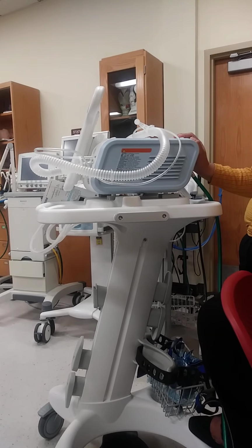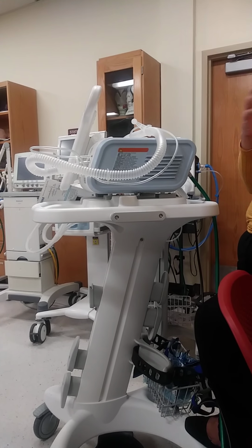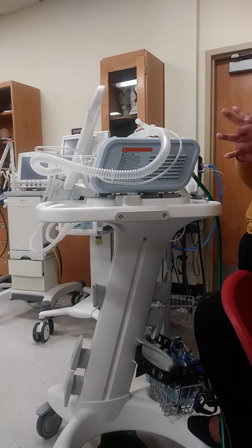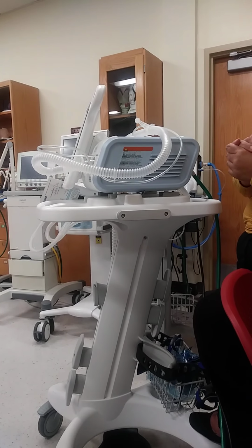And CPAP, basically what it is, it's a constant pressure that stents your airway open, and it prevents you from not breathing. So it helps you breathe at night. But we use this for sleep apnea patients also.